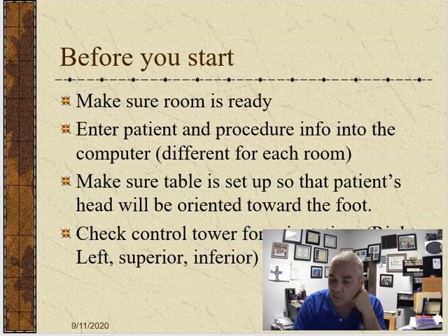So, it was a little bit of work. It would be you and a nurse, and the nurse would be making sure that all of her stuff was in order, and we'd be making sure all of our x-ray things were in order. Nowadays, much simpler. You just use a C-arm and go over to the endoscopy lab, and they've already got everything set up probably by the time you get there. So all we have to do is just start driving the C-arm.